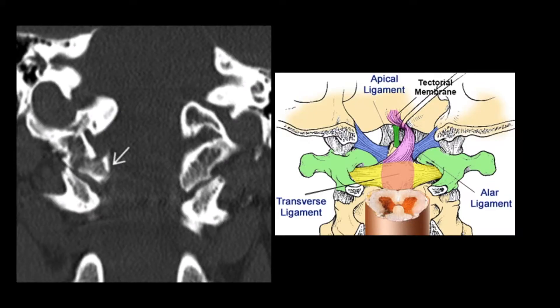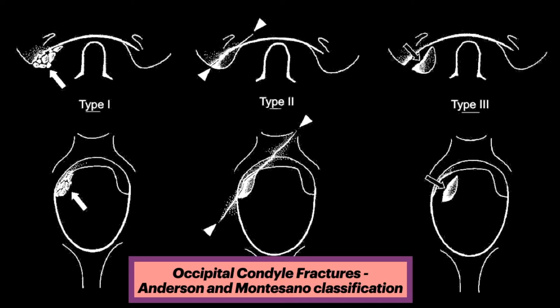Here again is the coronal CT showing the occipital condyle fracture where the alar ligament attaches. More specifically, this was a type 3 occipital condyle fracture.